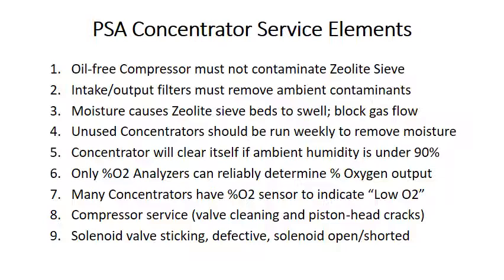Even though there should not be moisture penetration in an unused concentrator, it is very prudent to run unused concentrators at least weekly to remove the moisture. You never know how effective the valves are at sealing humidity out of the system. So a concentrator will clear itself of ambient humidity if the ambient humidity is under 90%.